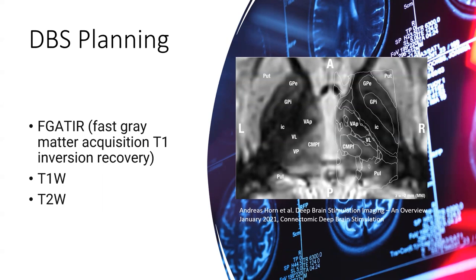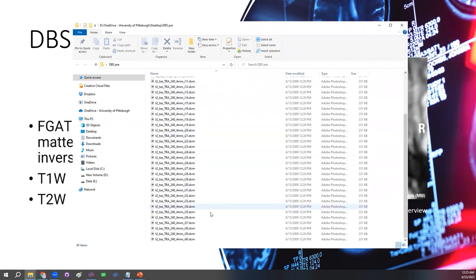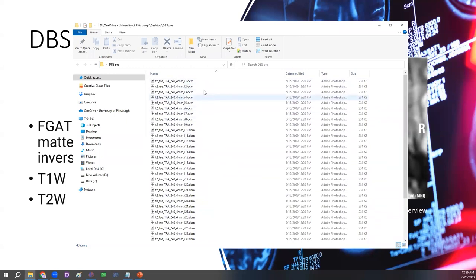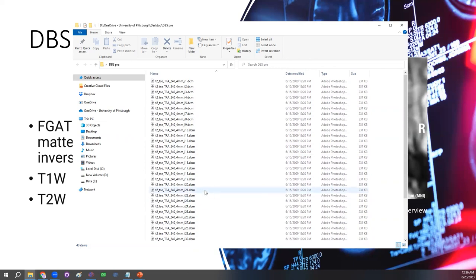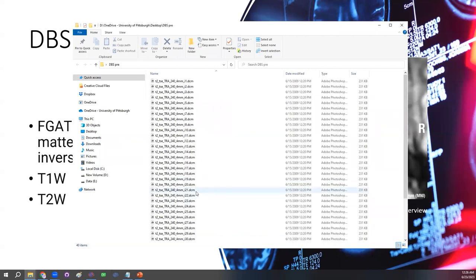Just to show you what the data looks like — the data I'm going to use in this video: the first is a series of DICOM images, similar to what you get from the scanner. Usually when you get it from the scanner, there won't be a file name or file extension, so you may need to rename it first. You can convert it using DCM2NII to convert it to NIfTI format. NIfTI format is what we usually work with, but for clinical applications like surgical navigation systems, we will still use DICOM. Today I will start with an example using DICOM.